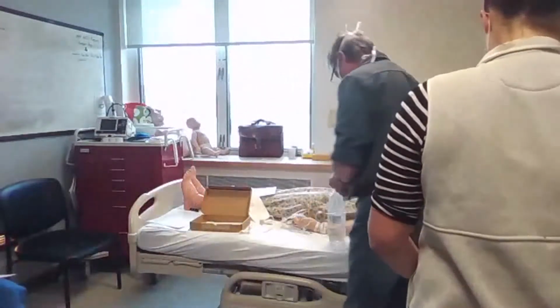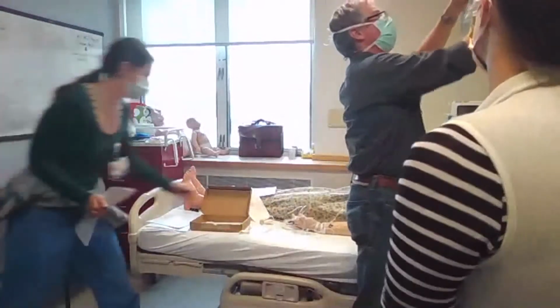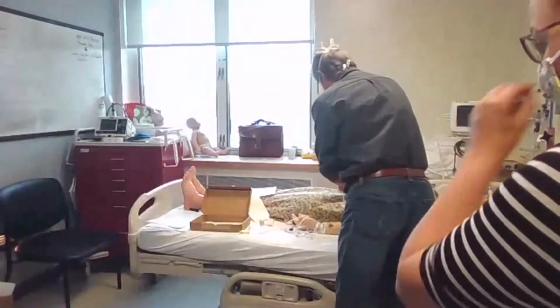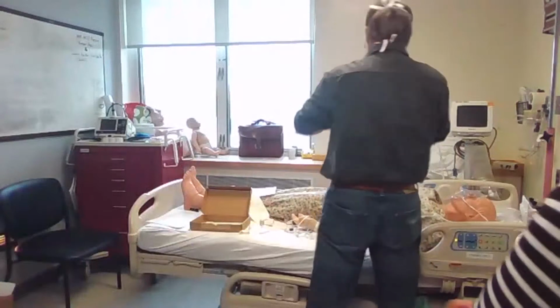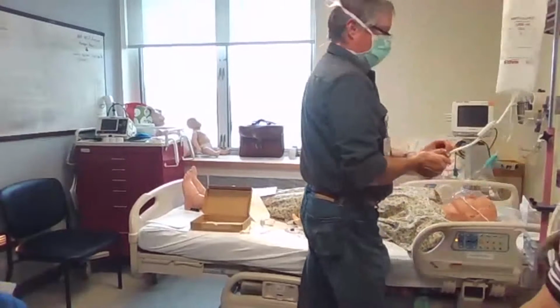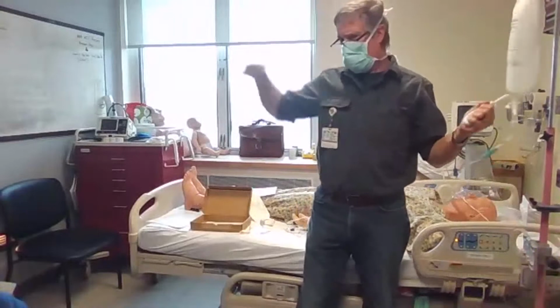So why does anybody think they have a hole in them? Why would you think they have a hole in them? So you can let the air out. Yeah. Exactly. So that's your next thing to keep air out of the system. Because we just talked about how air in the system causes damping. And damping just means it makes your signal either higher or lower intensity amplitudes.